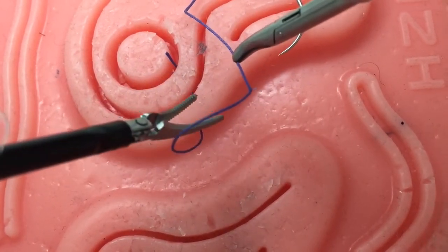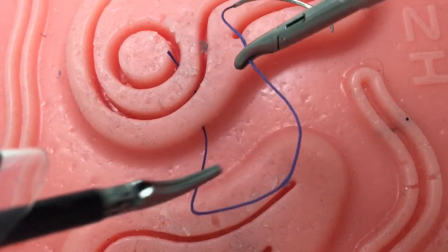And as shown, by creating an elongated U, we have effectively minimized our instrument to suture angle.